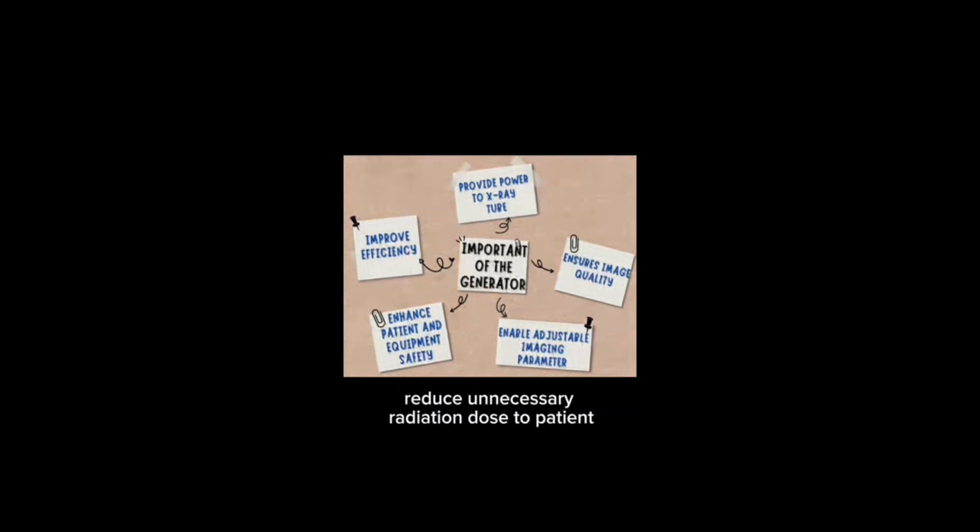Generators include safety mechanisms like overload protection, which prevents damage to the X-ray tube and generator components. Precise control over exposure settings reduces unnecessary radiation dose to the patient, ensuring compliance with radiation safety standards.